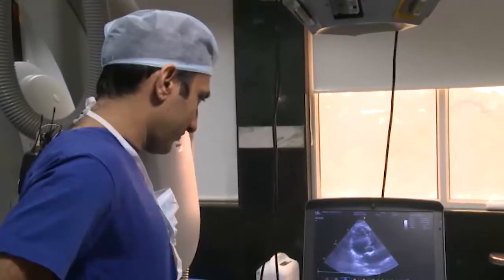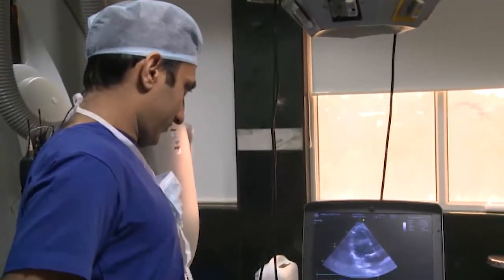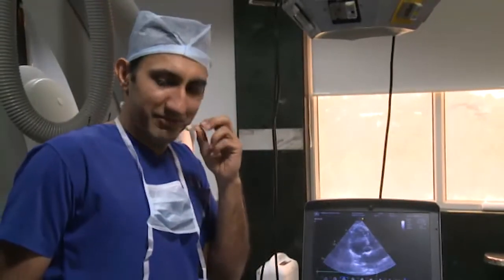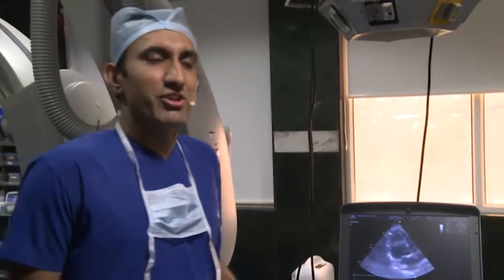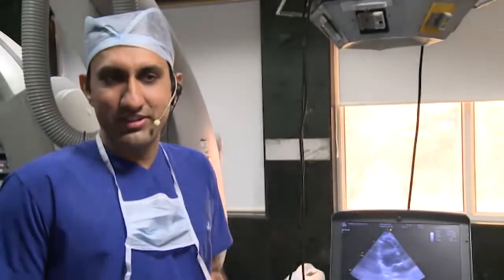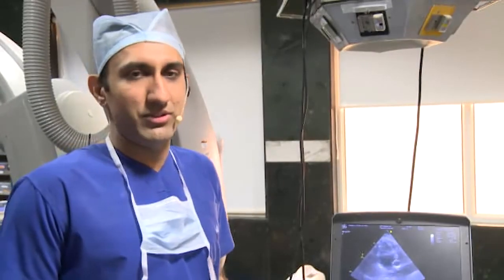Dr. Rao, welcome back, and share with us how you finished the case. Yes, Dr. Parikh, I can hear you. So we called in our vascular surgeons. We called for help. Can you hear us? So what we did is the sheath on the left side was a 22 French sheath.